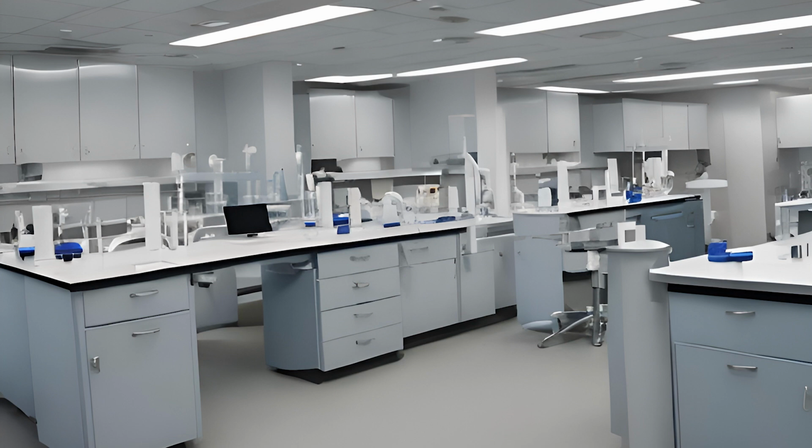When your test request is accessioned, it's assigned a unique number, which identifies the specimen, and all further work and documentation that is done with that specimen to connect it to the person, to the patient that you are taking care of. This is going to ensure that the right person gets the right work done and the right data is sent for the right patient to the physician.